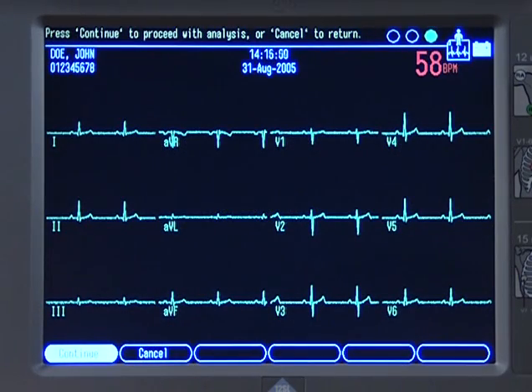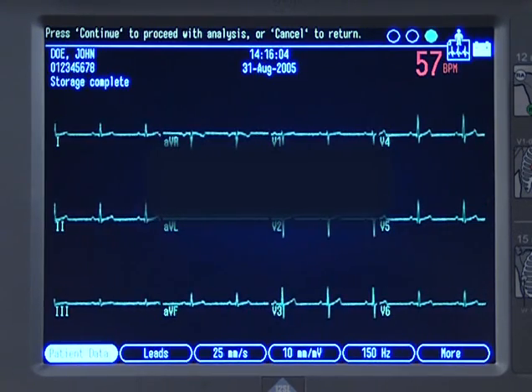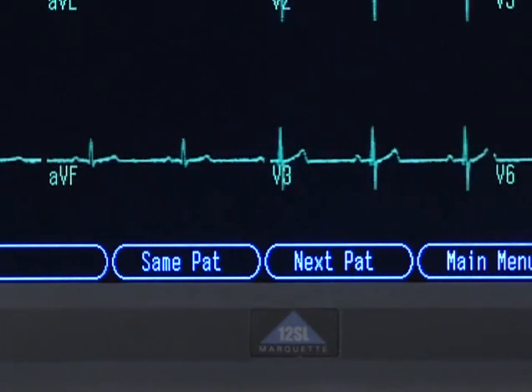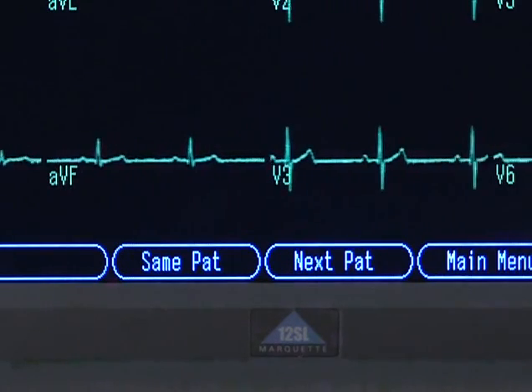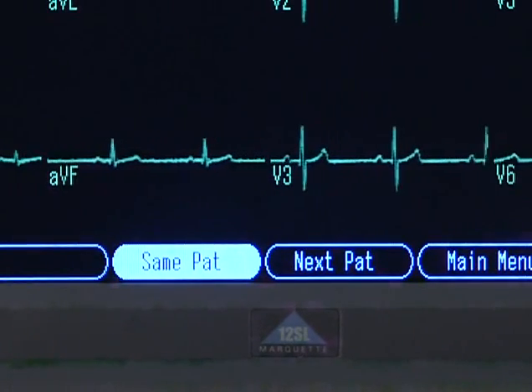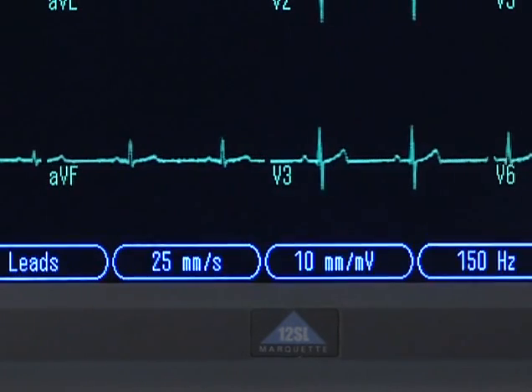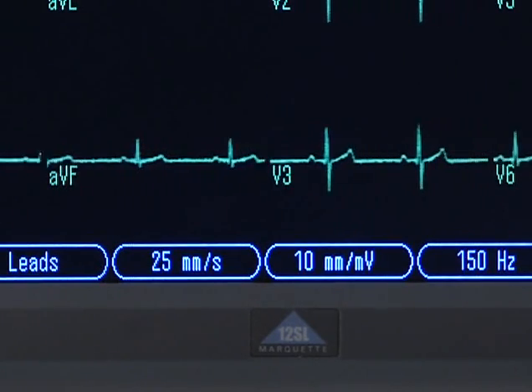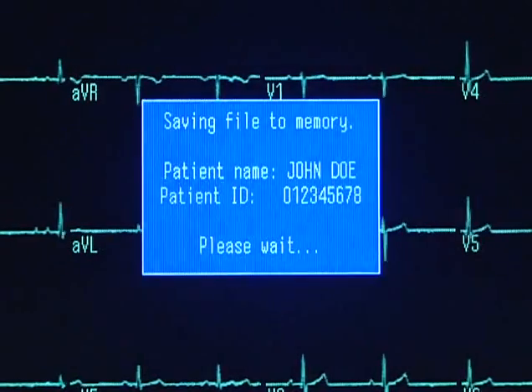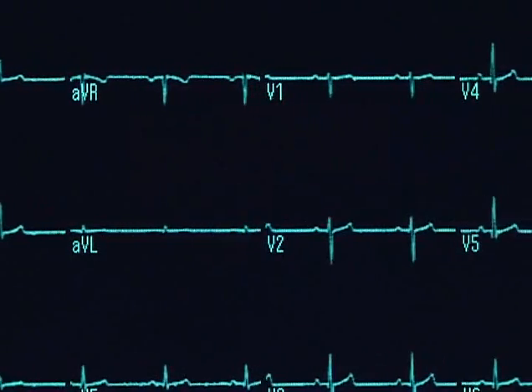When finished, you can choose from these options. Press F1 for Print or the Copy key on the keypad to get another copy of your report. If you want to continue with more tests, select Same Patient to acquire another ECG for the same patient, or select Next Patient. Our system is set to automatically store the ECGs. If the Auto Store feature is not set in System Setup, you will need to choose Store to save the ECG before acquiring another patient.